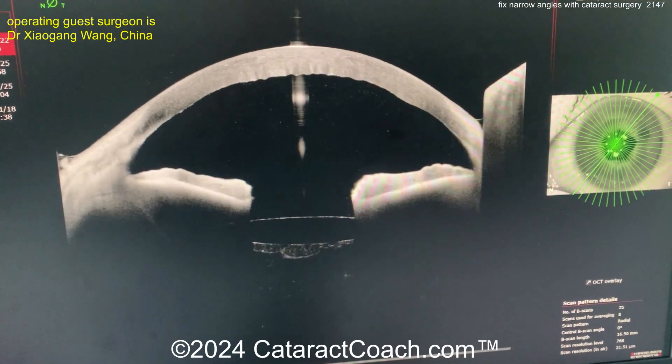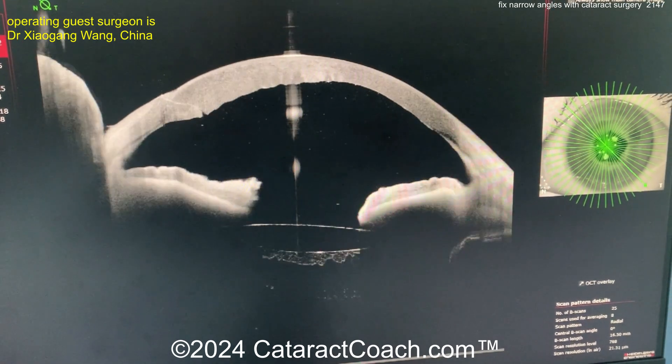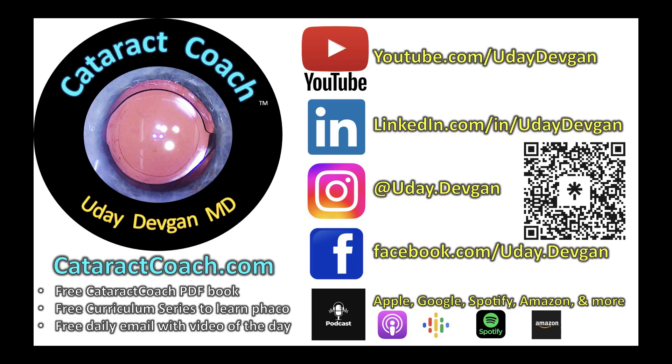Look at the post-op OCT — wide-open angle, IOL in the capsular bag, beautiful result. Nicely done. Remember our podcast: we literally give away the secrets to success in ophthalmology.